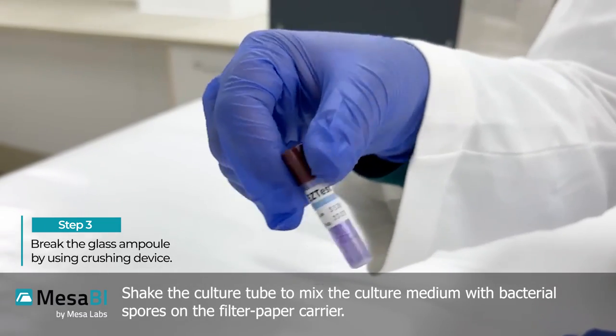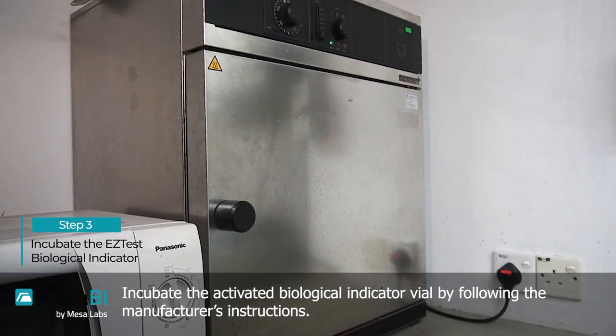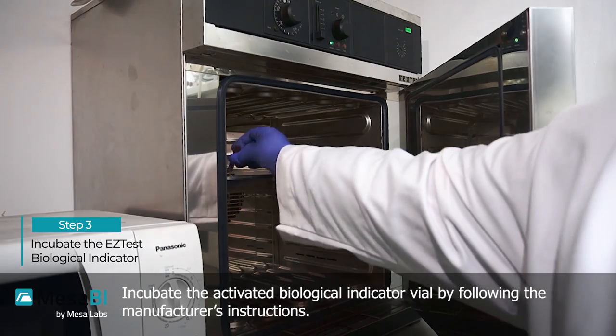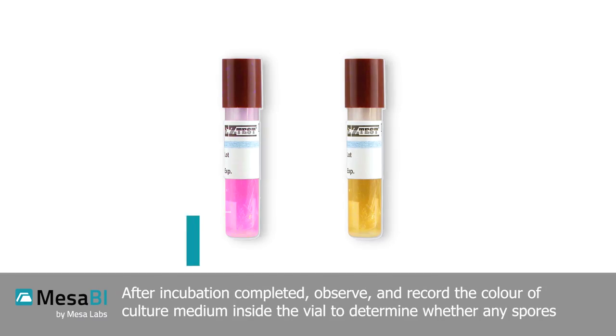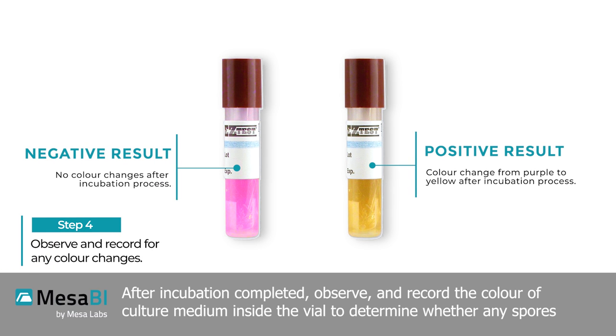Shake the culture tube to mix the culture medium with the bacterial spores on the filter paper carrier. Incubate the activated biological indicator vial by following the manufacturer's instructions. After incubation is completed, observe and record the color of the culture medium inside the vial to determine results.